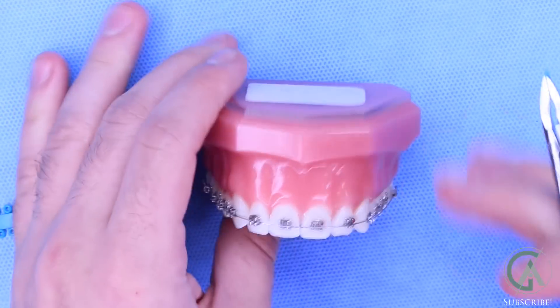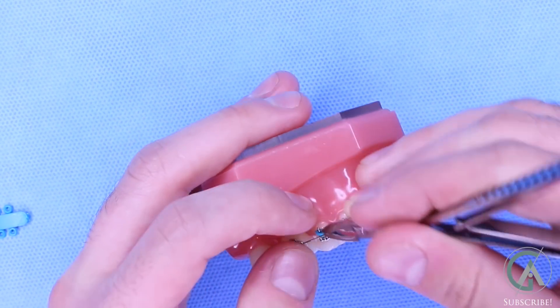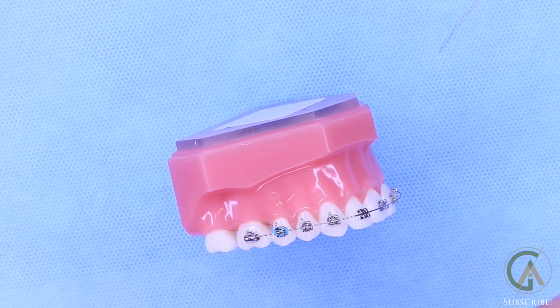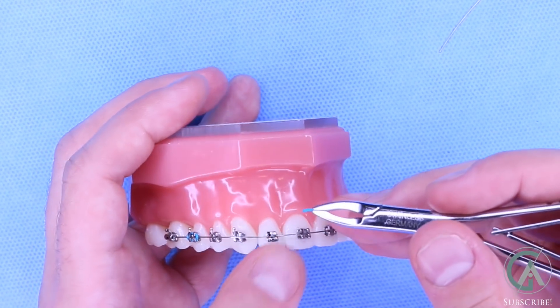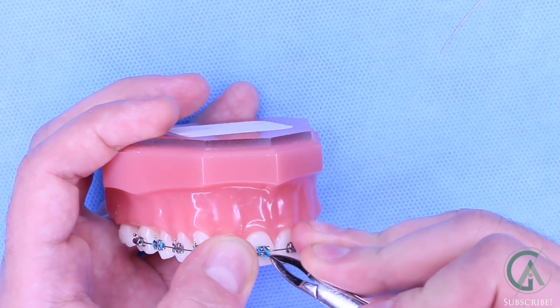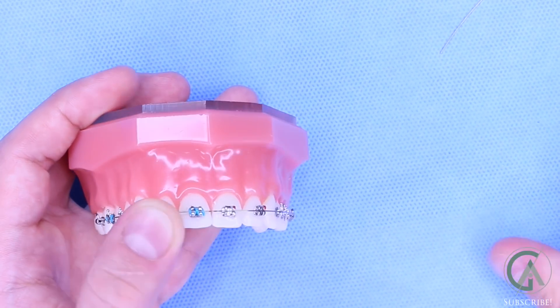What you'll see is that the four wings of each bracket will be tied in like that. Now, for certain teeth that need to be tied in a little bit more tightly, you might hear of your orthodontist putting on a figure eight tie. What the figure eight tie looks like is just that — it gets crisscrossed over your braces so that it looks like a figure eight.